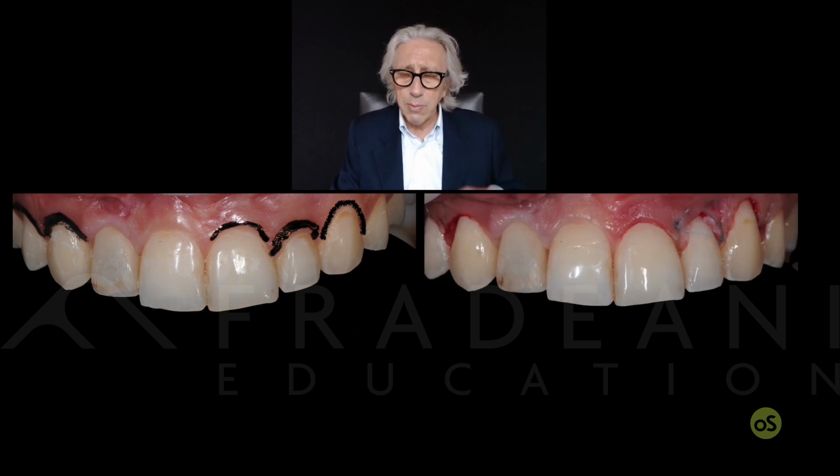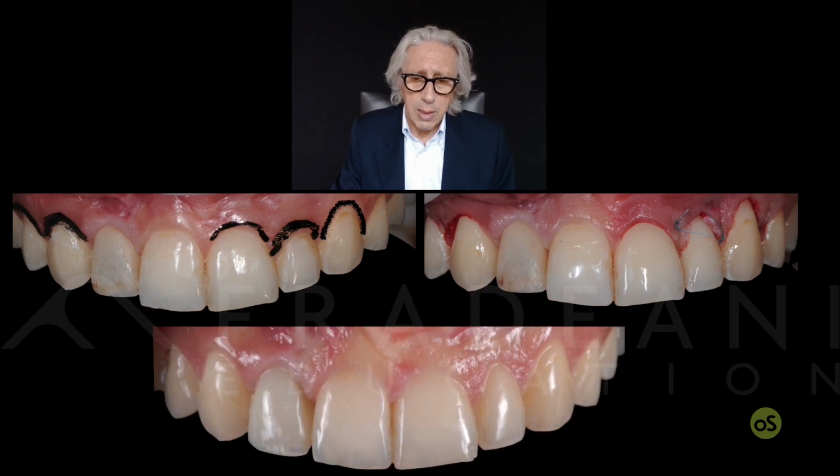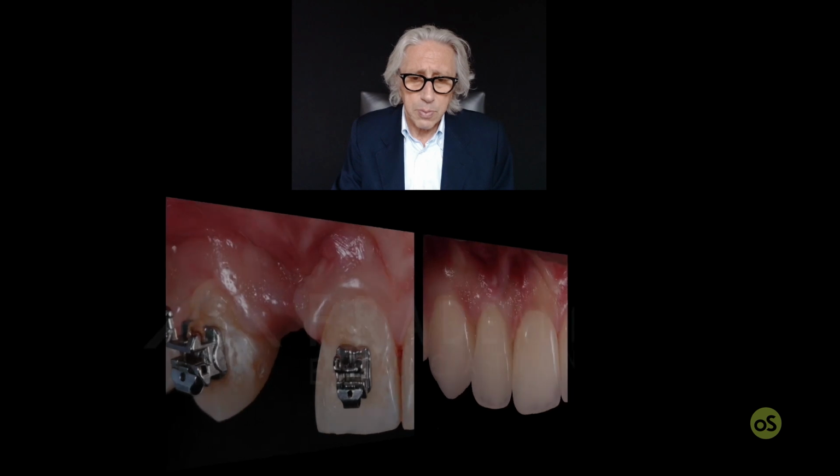So we have improved with a minor change in the surgical procedure, and we have the chance to optimize this level, as you could see from this picture, and with the lateral incisor that is within these two hypothetical lines, especially cervical, it is quite clear that we could have the chance to improve it. And at this point, we have the situation under control.